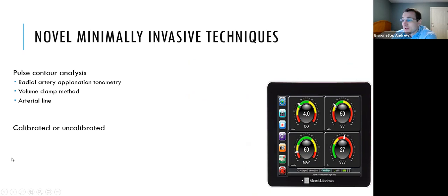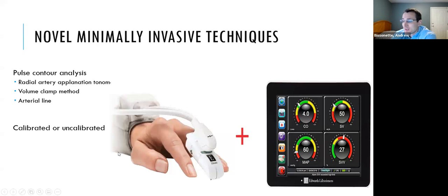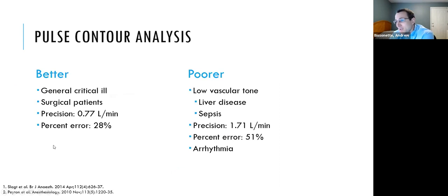However, the wave of the future may be very soon doing something like this, much less invasive, but potentially in the future as accurate. Pulse contour analysis is something that we are using with arterial lines, so I'm going to take just a quick second to talk about it. When we look at the accuracy and precision of cardiac output measurements, the most commonly quoted criterion for acceptable agreement with the standard thermodilution method is a percentage error of 30% or less. There was a meta-analysis of 65 validation studies with over 2,000 patients and over 45,000 observations where they compared pulse wave analysis with thermodilution.